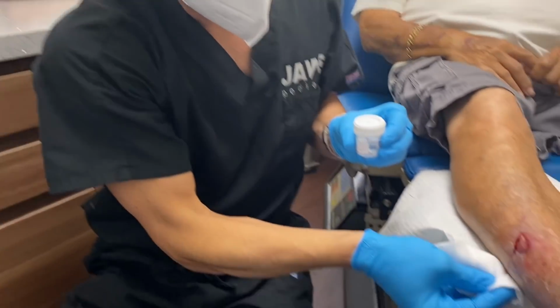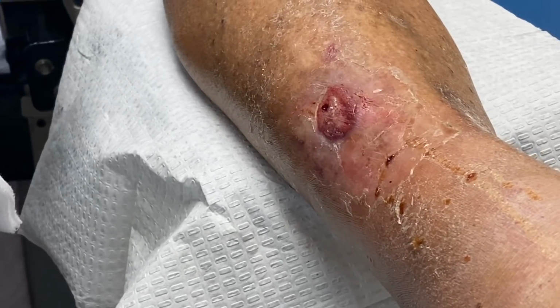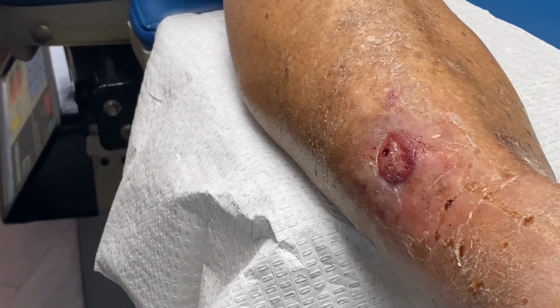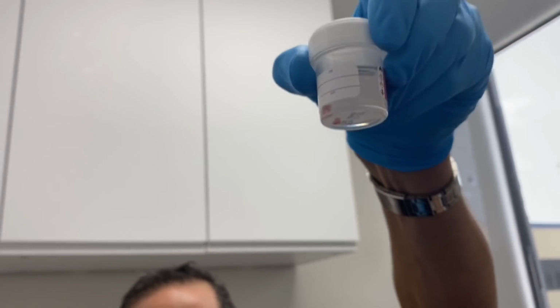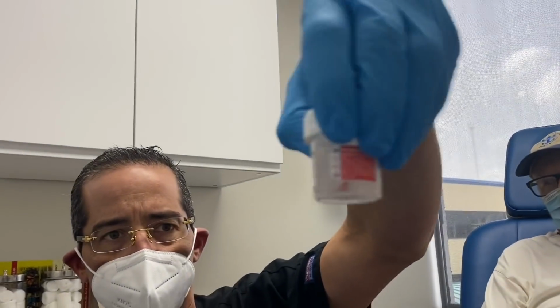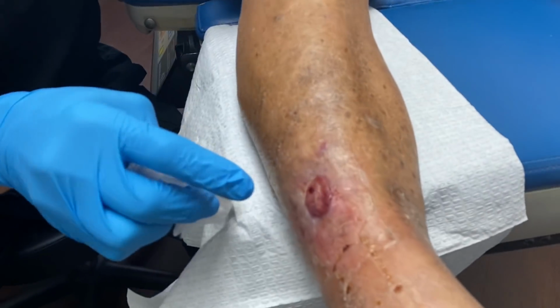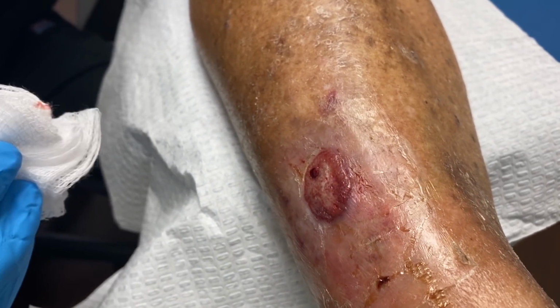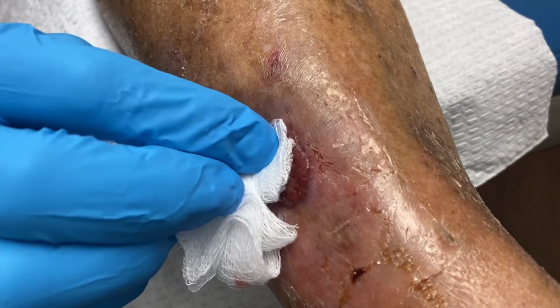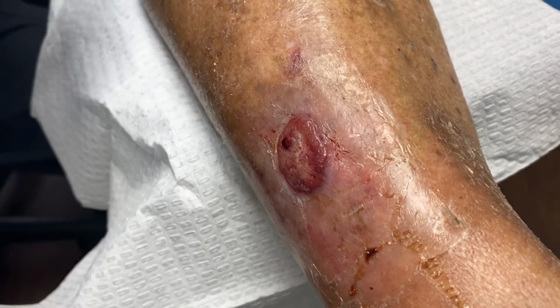Okay, even though it's bleeding a little bit, if I did not use the epinephrine, this would just be a bloody mess. And again, it's a 4mm punch. Can you see? Oh, can you see it from there, Susie? The proof is in the pudding. I want everyone to see this. So you see? That's what the epinephrine does. The epinephrine is a vasoconstrictor, and there's no bleeding. Okay? So we'll just do a little bit of local wound care, and the little defect will fill on its own.